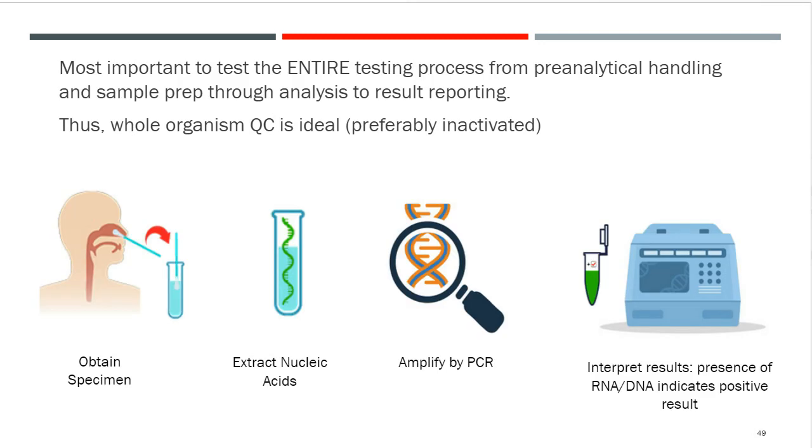Very importantly, perhaps most importantly, as we say here, test the entire testing process from pre-analytical handling and sample prep through analysis and result reporting. Don't assume everything outside the box is taken care of. It may not be. So if you're going to run QC, look for whole organism QC, so extracting and test result reporting from the system. And if you're going to deal with whole organism QC, it's usually recommended to make it inactivated. We don't need to bring biological hazards in.